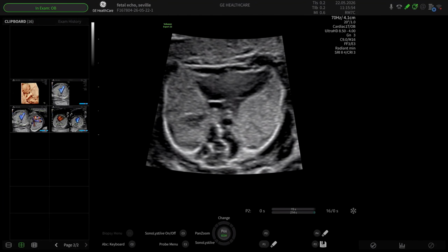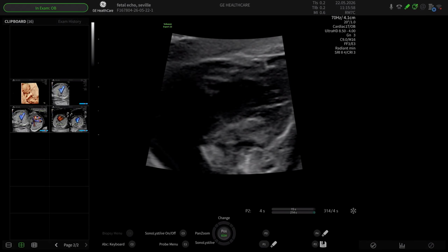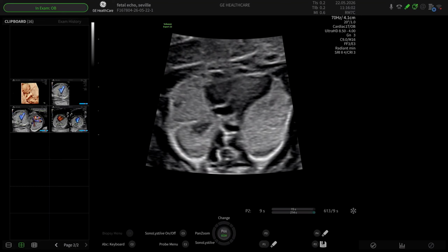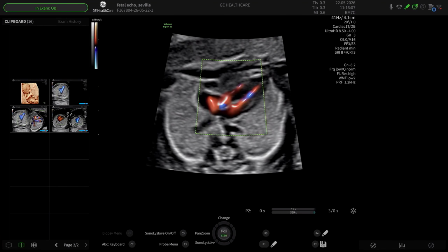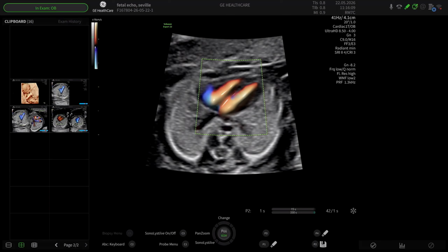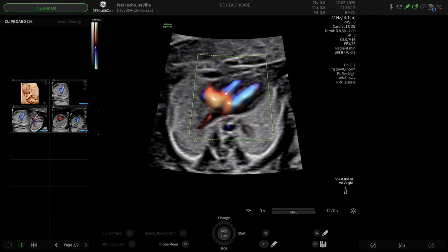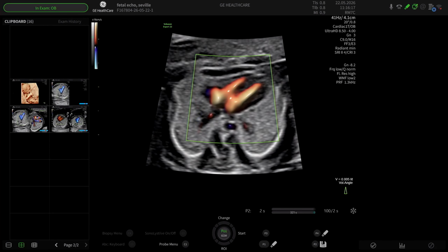And the STIC I'm going to do will include the thorax just as a screening STIC. As I'm pressing here, I'm maybe just pressing too hard on the abdomen, I'm squashing. Thank you. And now I put on my color. Once I'm on my color, I'm going to increase my acoustic output. And then I'm going to select 4D. And when you're doing a STIC volume, you start at the top and work down. So I'm on first trimester.